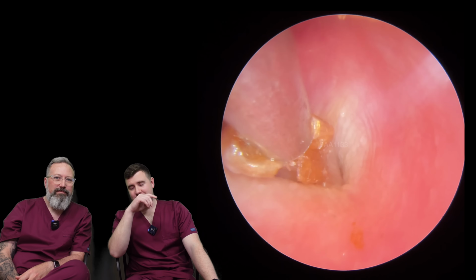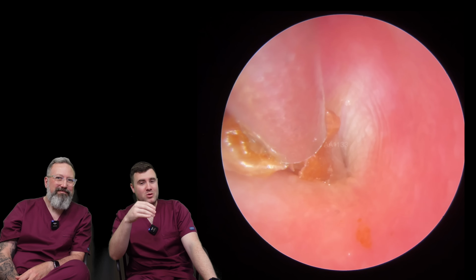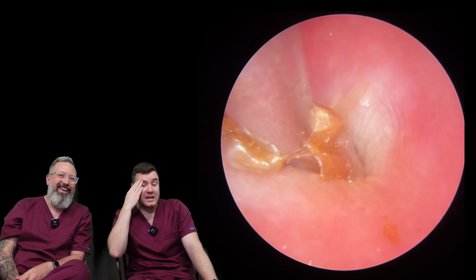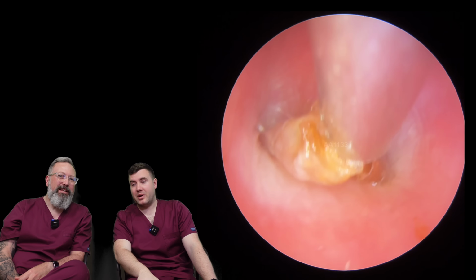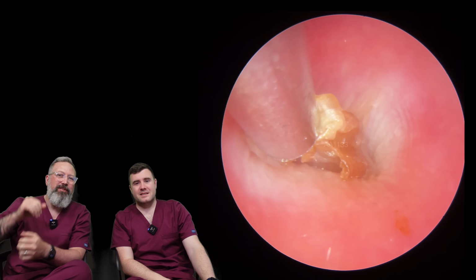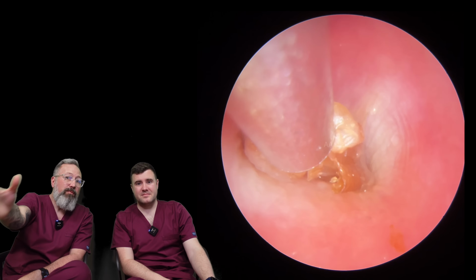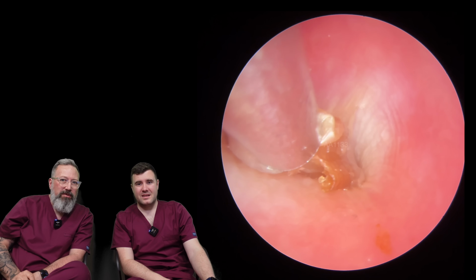This was a really frustrating one, because you can see it looks like it's almost out. It looks like it's almost loosened up and away. But it was just really holding on. There was something locking it in place there. It's almost that bit that comes over the top of the recess. I think it's that little V at the bottom that's just wedging it all in. Some of it has come away from the top of the eardrum and from the canal walls, but it's always that bit down the bottom that's causing this issue.